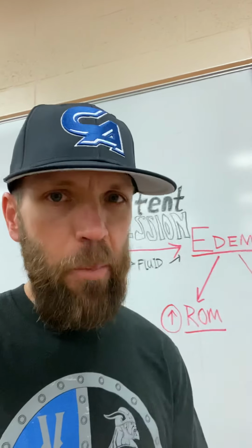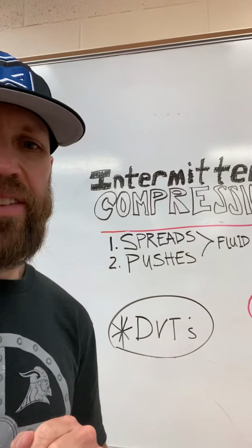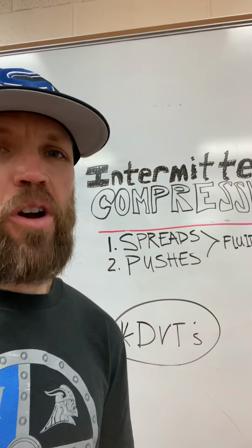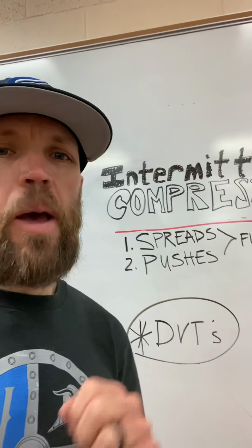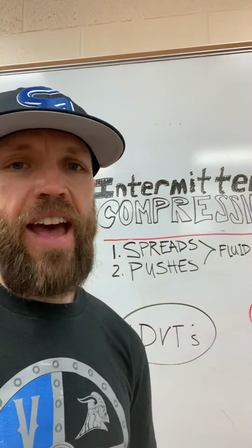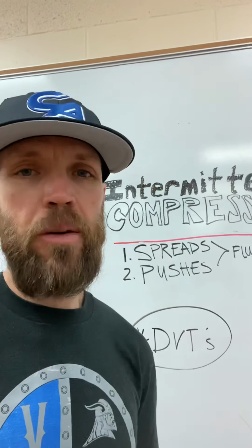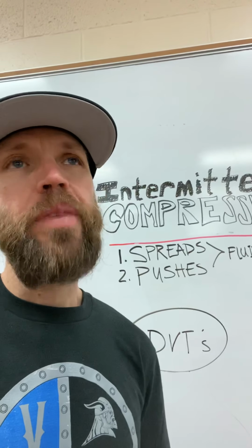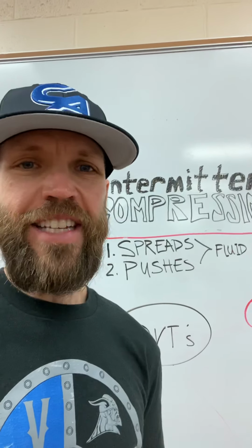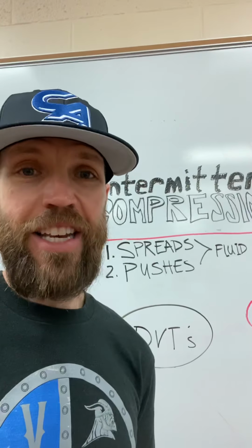Now, before we look at those devices, let me just come over here and talk about this little trickster right here, the DVT. We all know that deep vein thrombosis is a big safety, big red flag item for us in therapy. We don't want our patients to have those. So what are we going to do? Well, we're going to pay attention to the fact that intermittent compression is a great prevention tool for DVT, but it is not a great treatment tool once a DVT has been diagnosed.